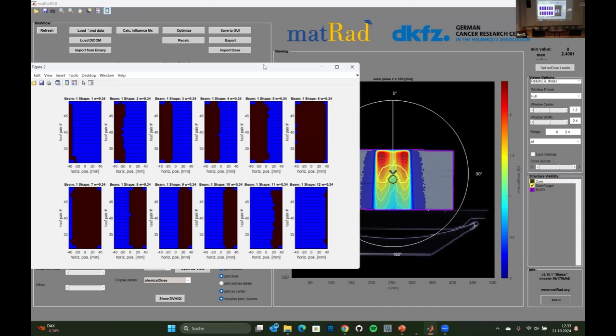Then you get some interesting, artsy looking color levels for your image. That's kind of the same thing the sequencing algorithm does. It says, I have this continuous fluence map, this continuous modulation, with continuous values that my optimizer found.